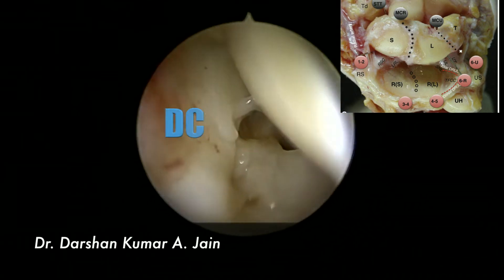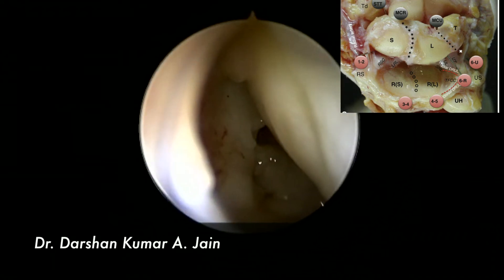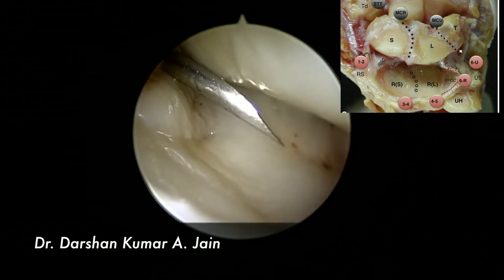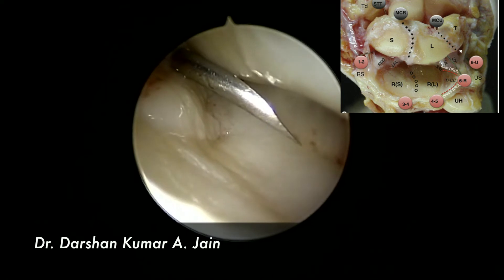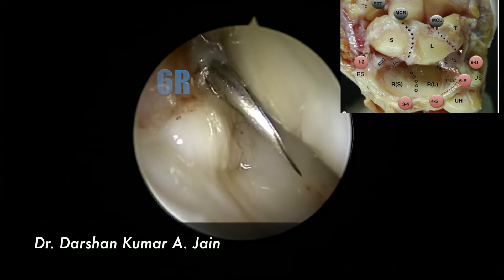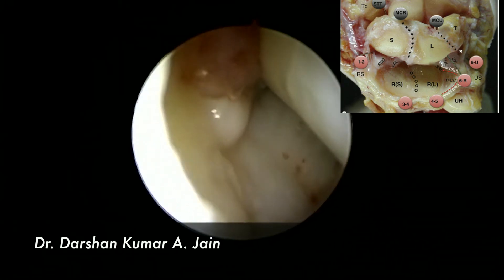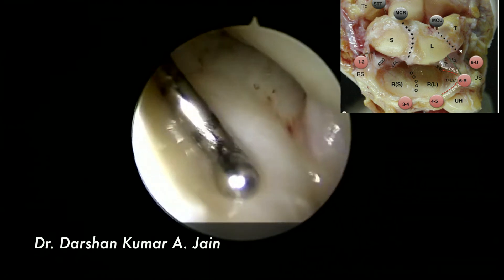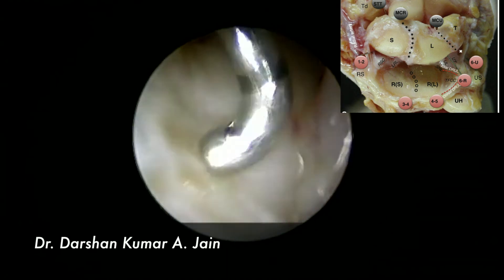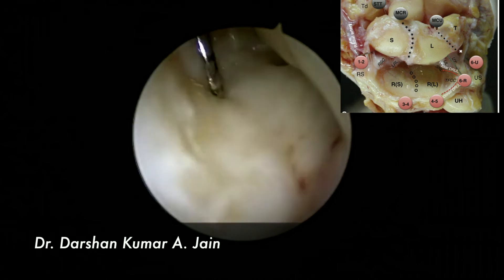That's the dorsal capsule and the capsular reflections on the carpus. The 6U portal is made under direct vision so that the needle exits above the TFCC. Once the portal is made, you check the TFCC — as you feel the tension, that's called the trampoline test, which is good here. You could also hook the TFCC at the small rent and identify the foveal attachment, which is also good in this case.